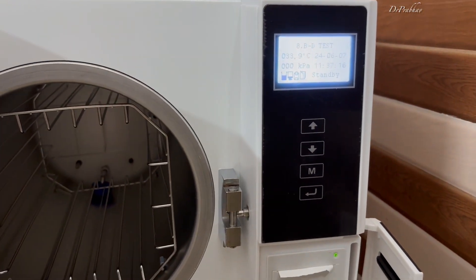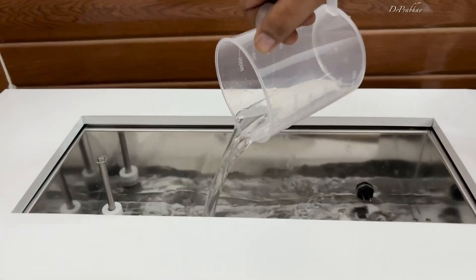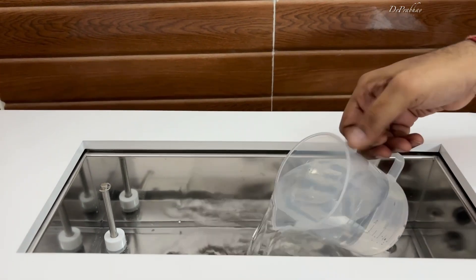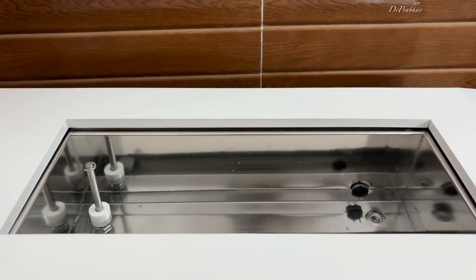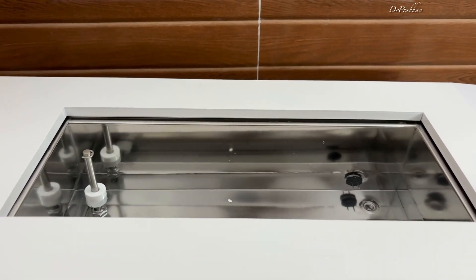In the desired chamber, we are placing the instruments — we can place them unwrapped. The second step is we need to pour in distilled water and fill it up to the maximum level. This distilled water will be used to create a vacuum and sterilize the instruments inside.